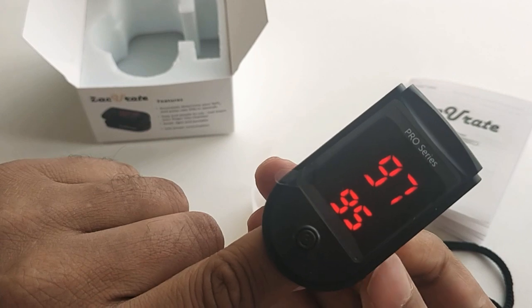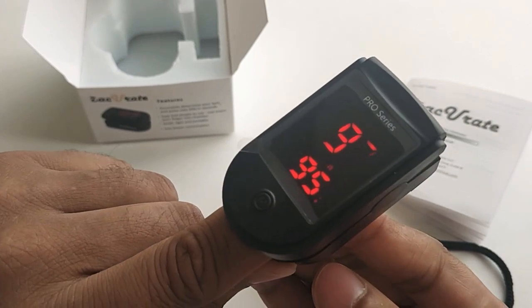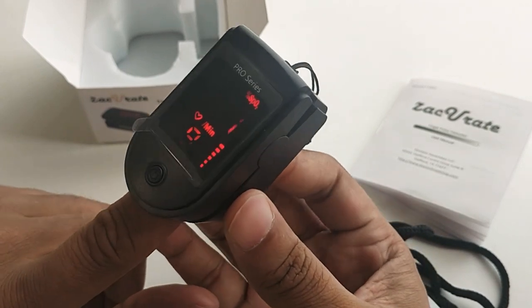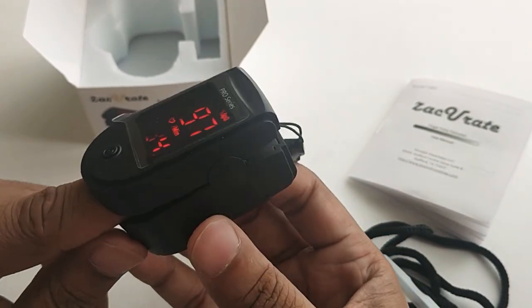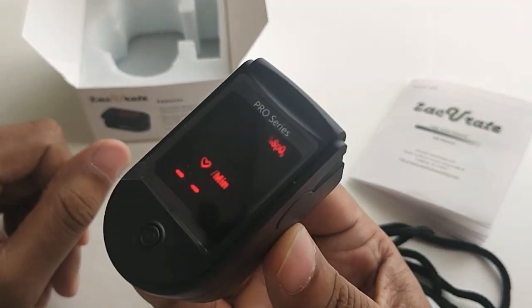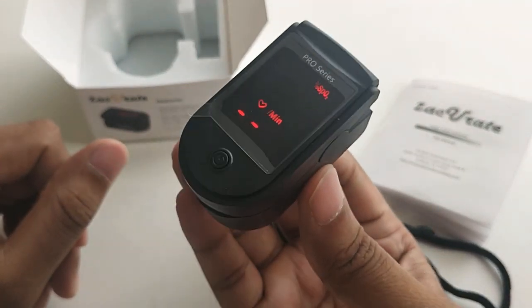You can see here 97 and 98 on the display. Once you remove your hand, within eight seconds it gets automatically switched off.